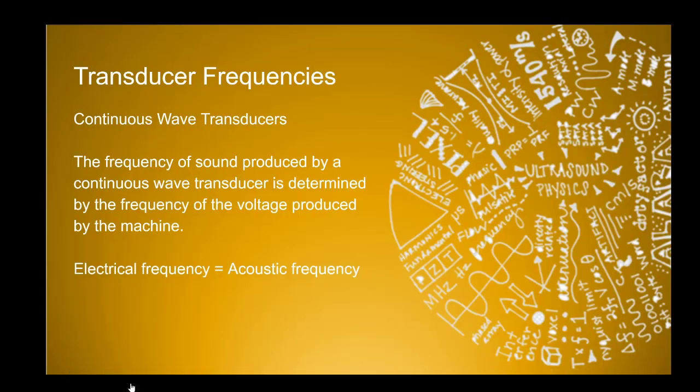So that last little part was a little bit of a departure from what we've been talking about, but it does just kind of make us aware of how the piezoelectric material becomes piezoelectric, and then why we don't sterilize versus disinfect. All right, so we're going to kind of jump back into the physics side of things, and we're going to look at transducer frequencies. And we're going to look at then how the transducer frequency is created.